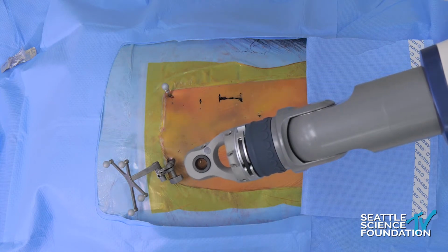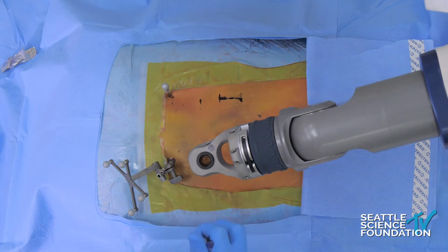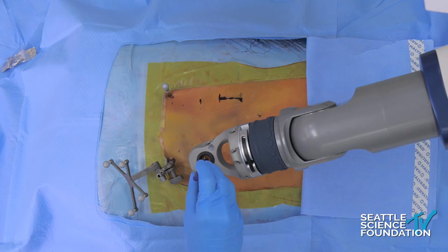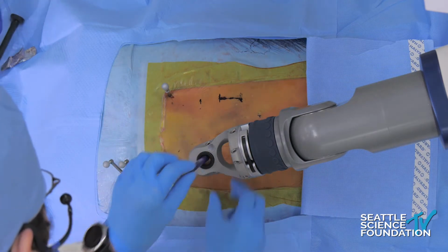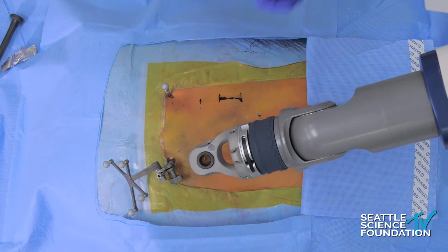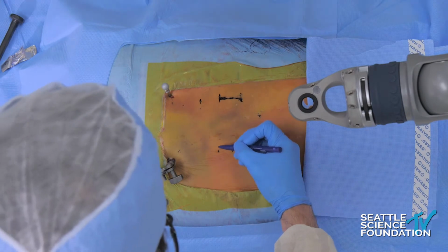Appears slow a little bit. I think the upgraded software is much faster with respect to certain motions for the robot. And there you are. And then if we need to get the robot out of the way, I just deselect the screw. There's a collar which I'm able to move out of the way. And we can kind of get to work.